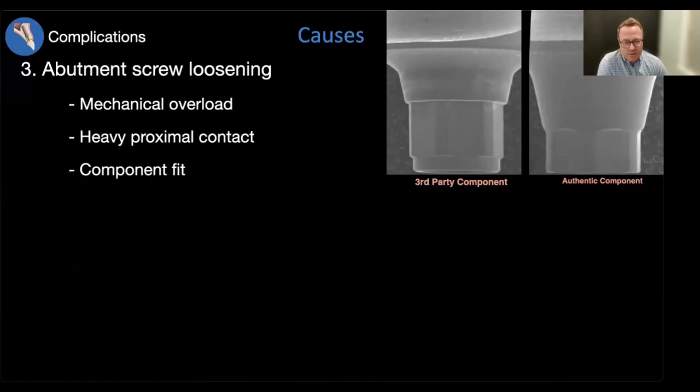The other part I always am a big fan of is the focus on using authentic parts versus third party. And the reason for that is when it comes to things like screw loosening and damaging implants, while a third party component will fit into an implant and clinically I won't know the difference, when you look at them under high magnification, there can be significant differences. Not always, but there can be. And it's hard for us to know which ones are better than others.